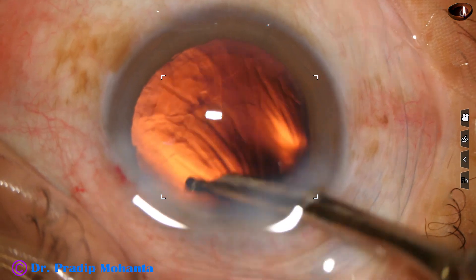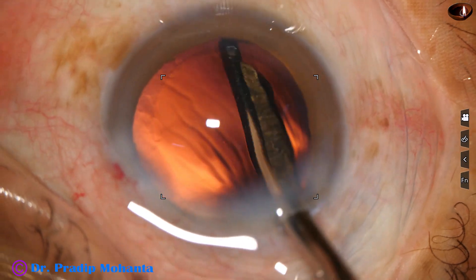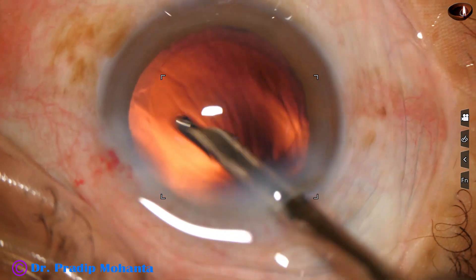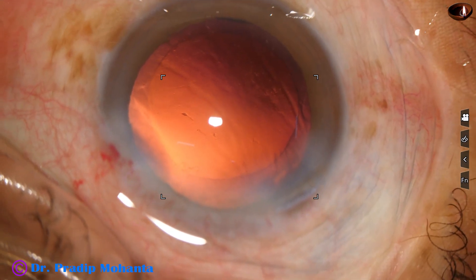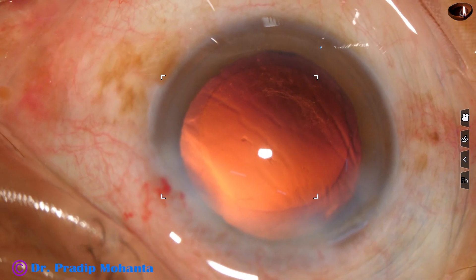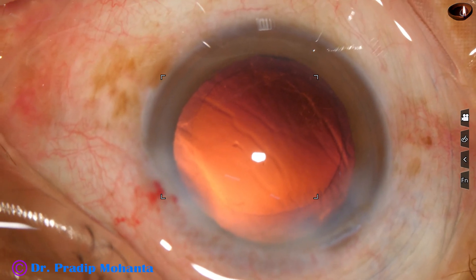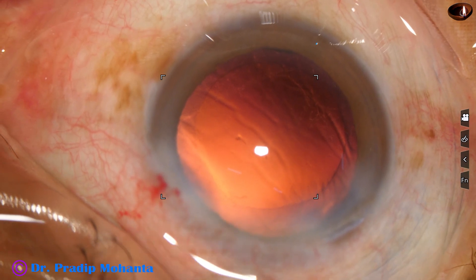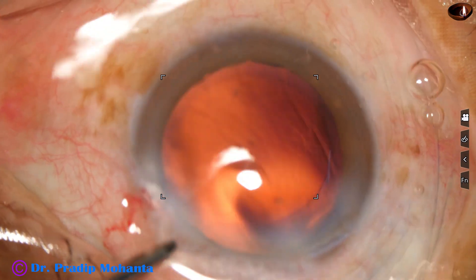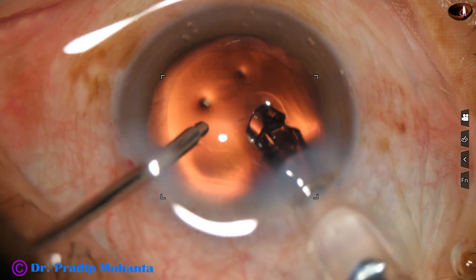We are having very nice red glow in this case. The microscope is Topcon's OMS 90, a basic microscope. The recording system is a beam splitter — an indigenous beam splitter and a Panasonic GH5 DSLR camera. There is an adapter for fitting the camera to the beam splitter.